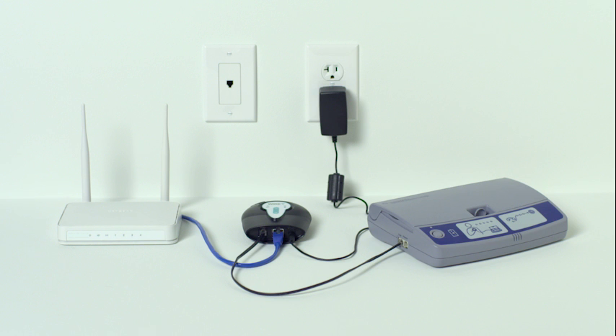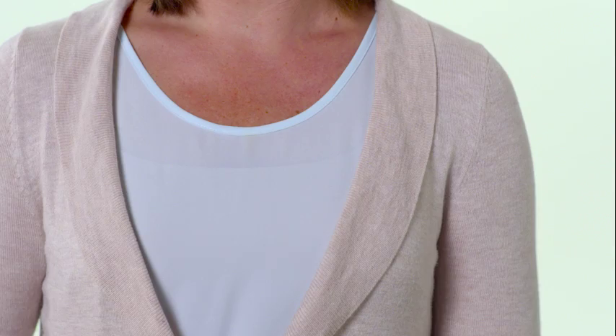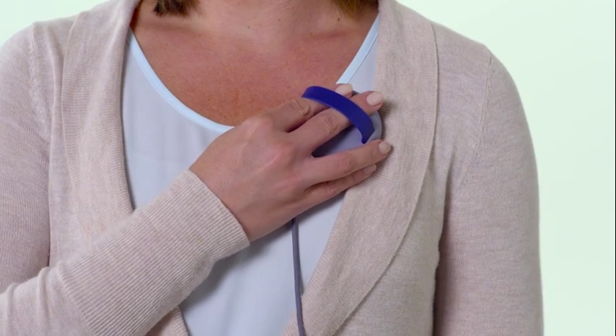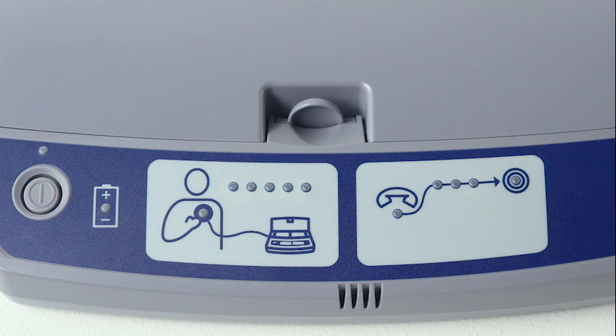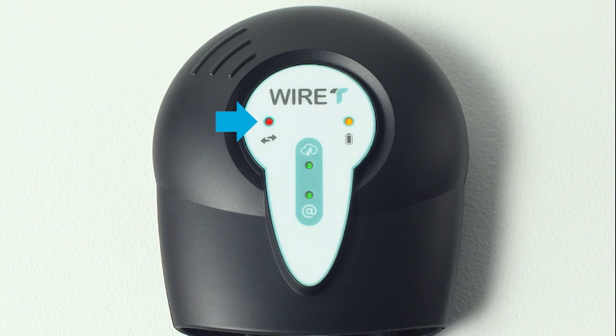The wonderful thing is that once the internet accessory is set up, you will use your existing monitor in exactly the same way you always have. So go ahead and place the antenna over your heart device and press the monitor's button to send heart device information to your clinic. During a transmission, you'll see the information light on the internet accessory go on.